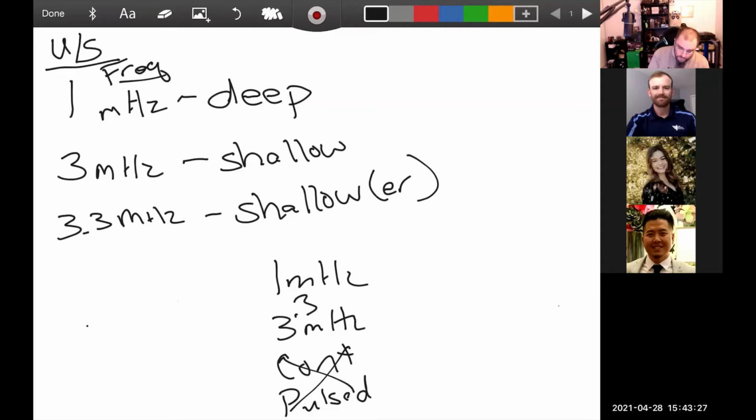Right? Is that a precaution also? I don't know if I'm saying it right, but the epiphyseal plates, yep. So growth plates, right? Is that a precaution or a contraindication? So this is up to the PT to decide, not for you to decide, Brooke. If we have a fracture of the epiphyseal plates, we can do pulsed ultrasound on it to help the fracture heal. But if they are a kid and have epiphyseal plates that are not fractured, that would be a contraindication. So I wouldn't want to do ultrasound of the lateral epicondyle of the humerus on a kid because the growth plates are still open there, if that makes sense.